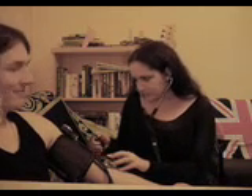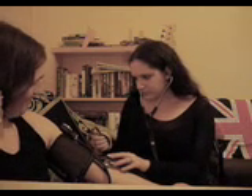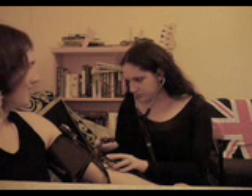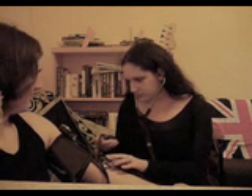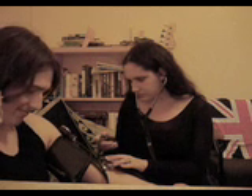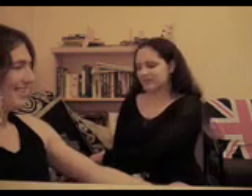You ready? Ready. 121 over 70. 121 over 70. Fabulous blood pressure — what can I say? Try to keep perfect in every way.